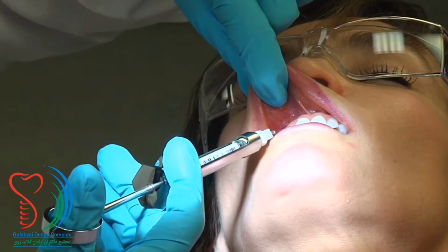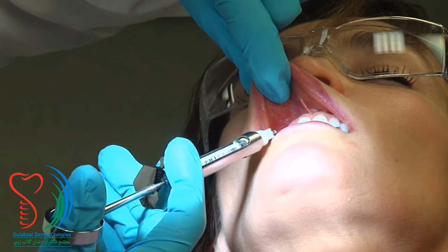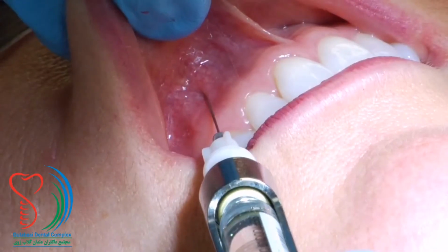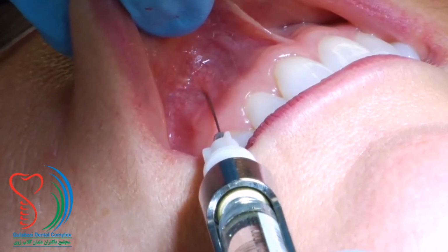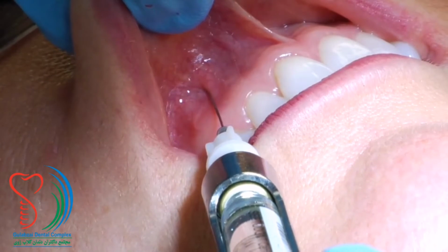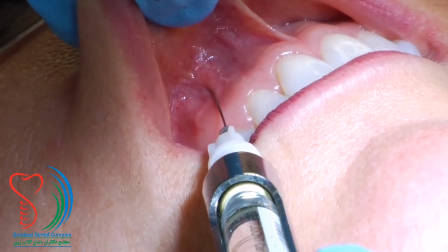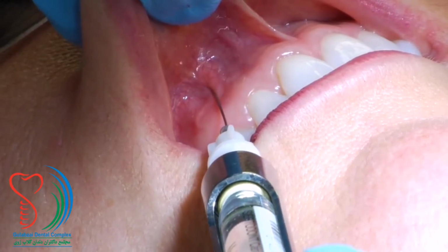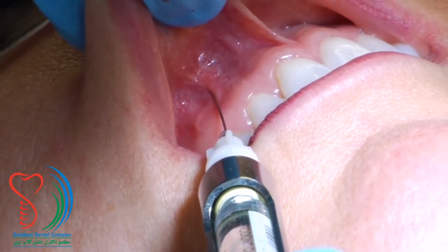Align the barrel of the syringe parallel to the long axis of the tooth, following the contour of the maxilla. Advance to a maximum depth of 1/4 to 1/2 inch. After a negative aspiration, deposit approximately 1/2 of a cartridge of the anesthetic solution with multiple aspirations.